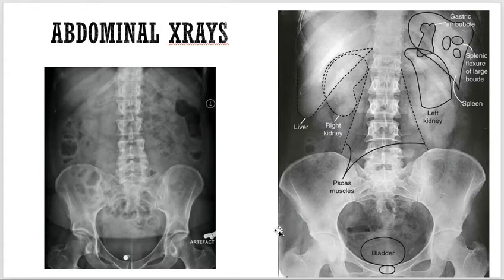So see, you can see the normal anatomy: we can see the lungs, we can see the ribs, we can see the vertebrae, we can see the air in the bowel, we can see the bones, ilium, sacrum, sacroiliac joint, pubic symphysis, okay, ischial tuberosities, femur.